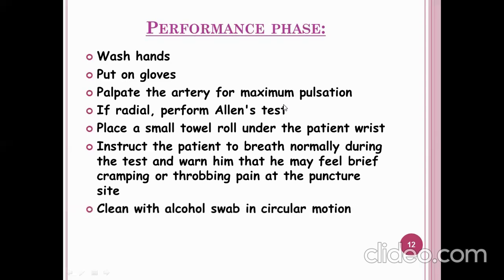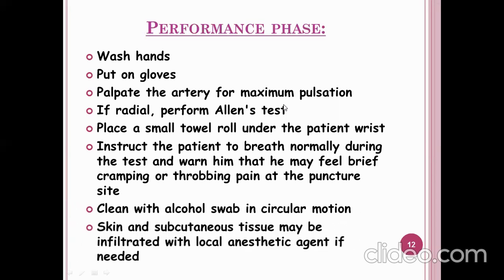Clean with an alcohol swab in a circular motion. This is the way to clean the puncture site before the puncture. Skin and subcutaneous tissue may be infiltrated with a local anesthetic agent if needed.